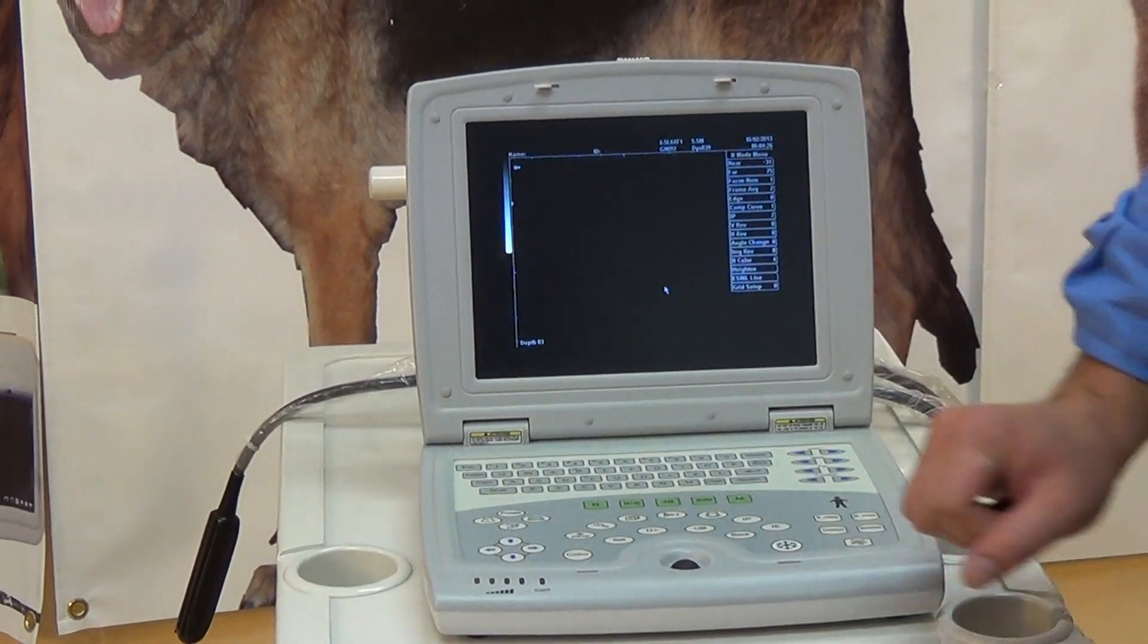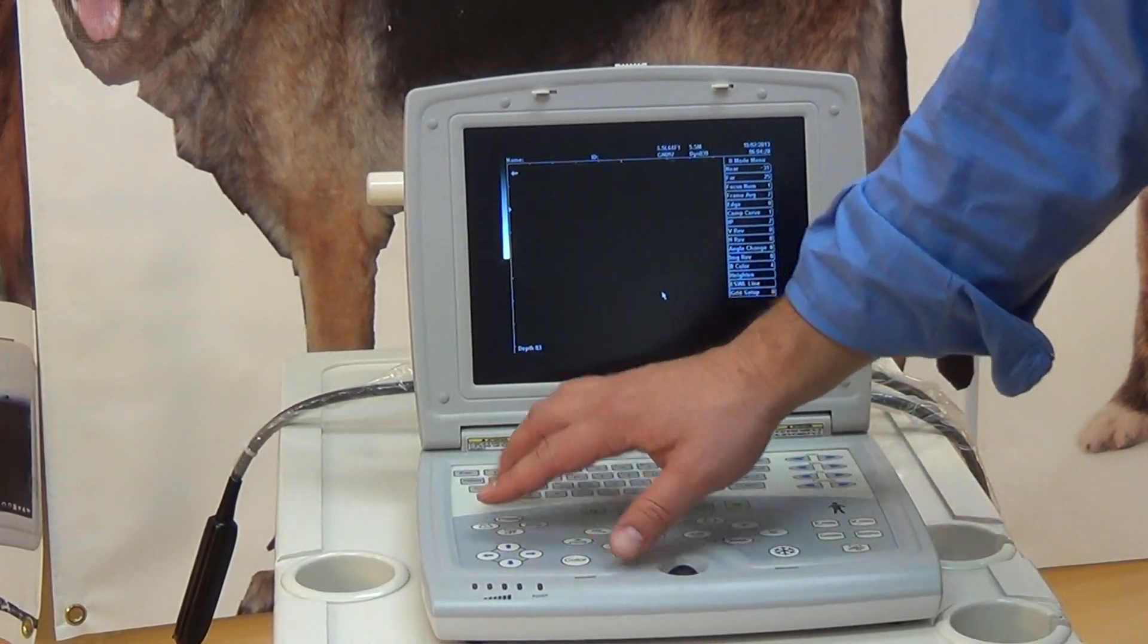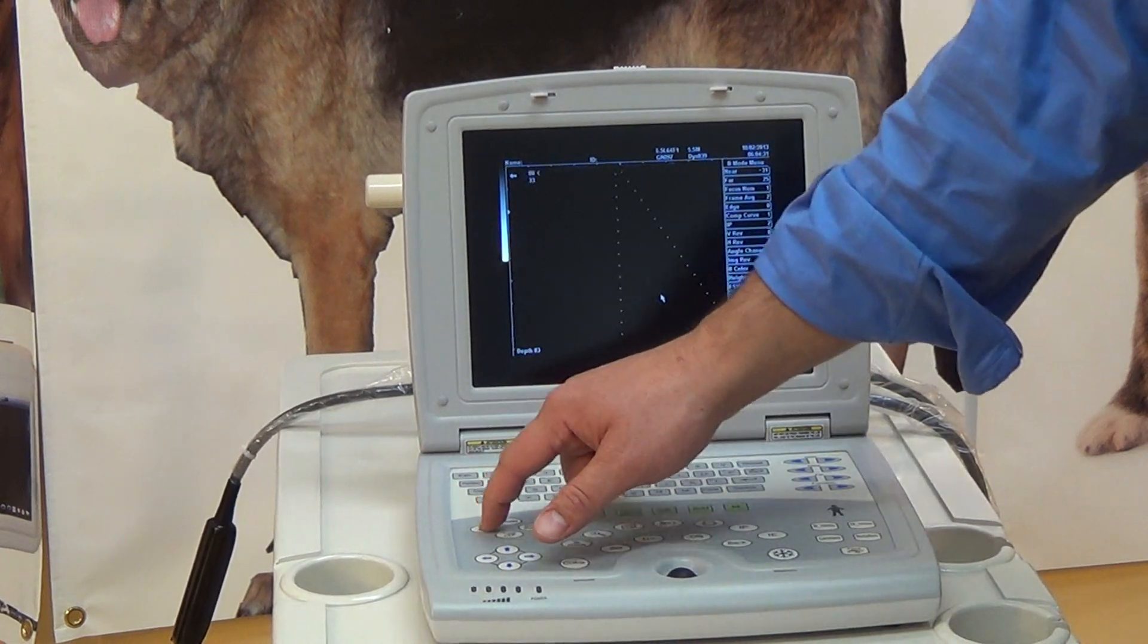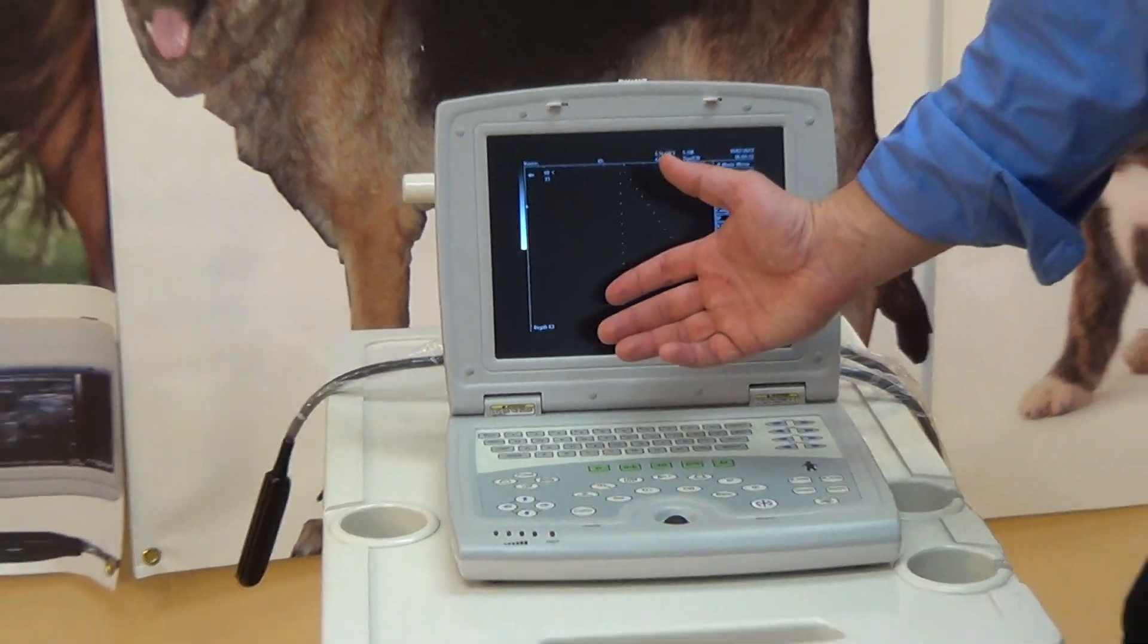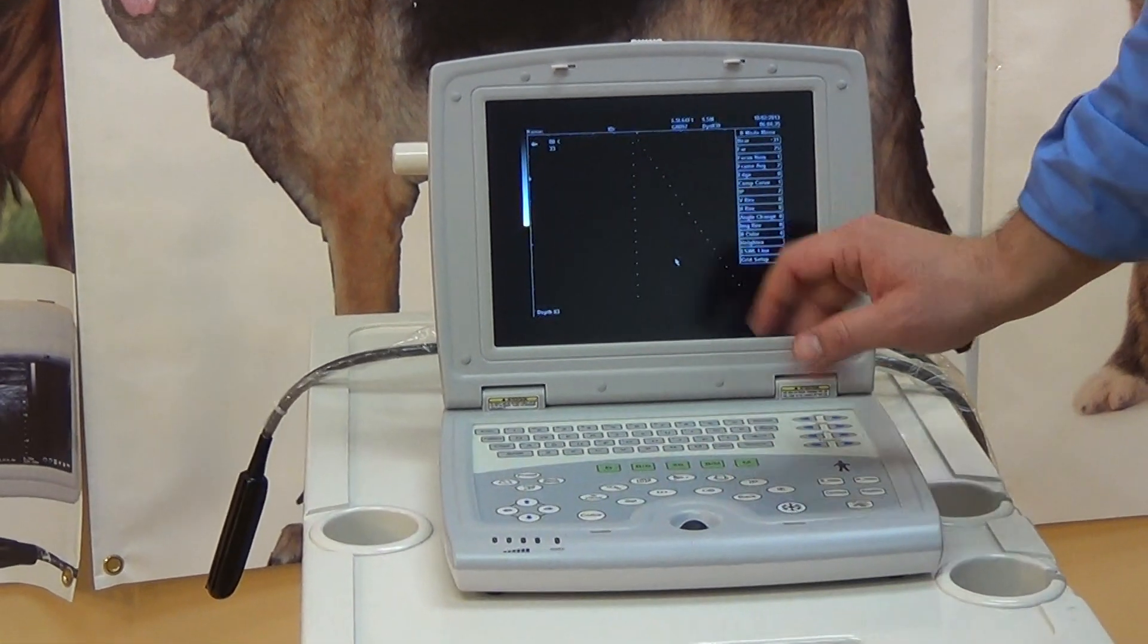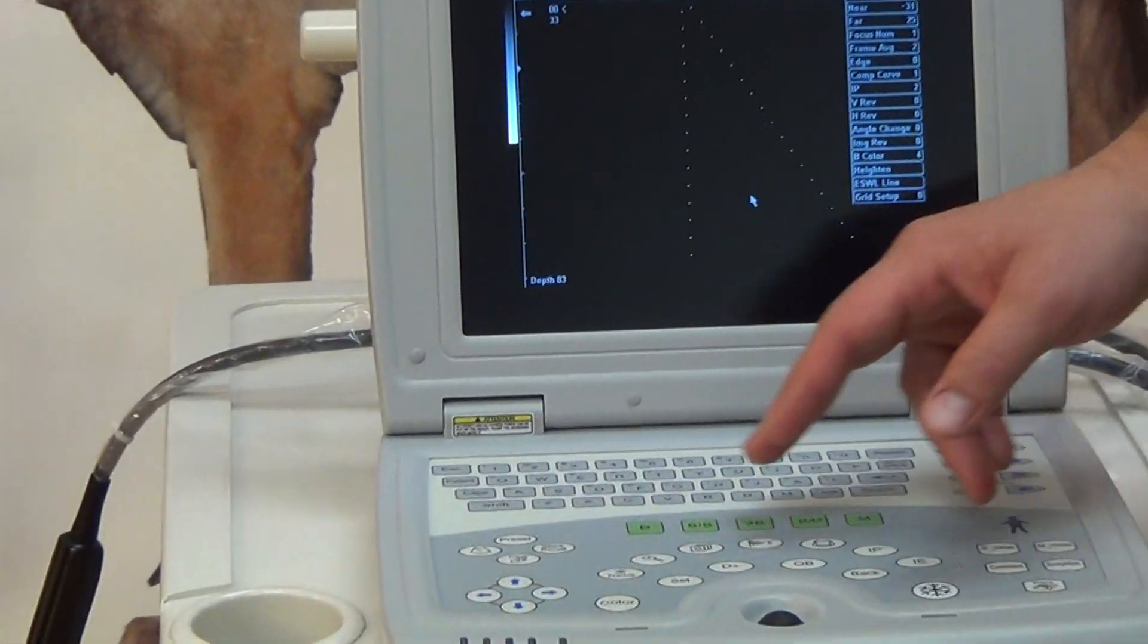And then we have our start on the left side and move across. This button over here is if you're doing a biopsy, you have some sort of needle-guided procedure. Not very many people use that, but sometimes veterinarians, it's possible.